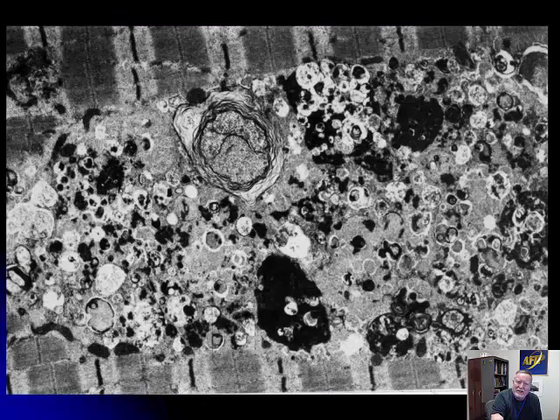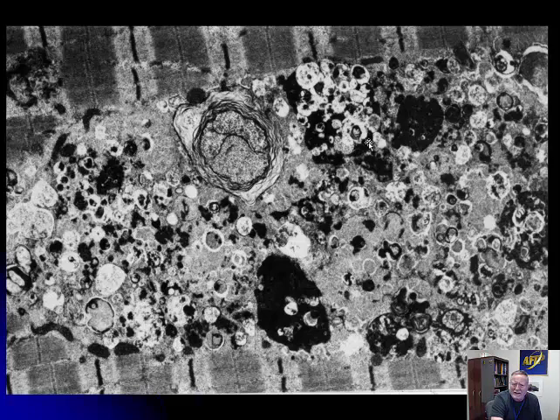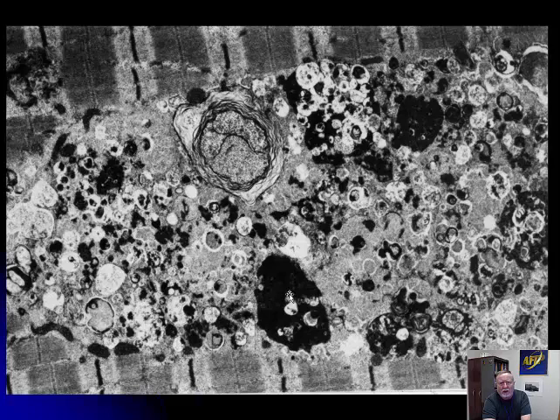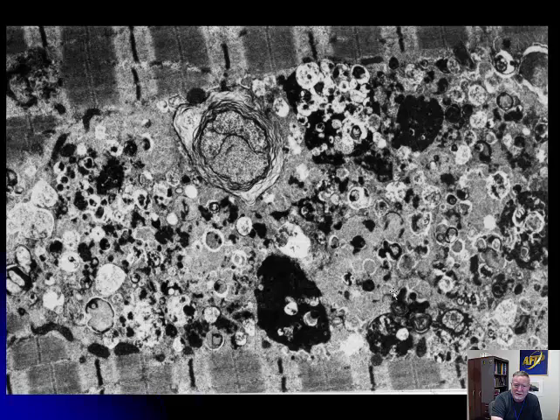Damaged skeletal muscle — here's an odd case of acid maltase deficiency, which is type 2 glycogenosis, also known as Pompe's disease. You can certainly say this cell is irreversibly damaged, with damage to both extra- and intracellular membranes. Look at the formation of these lamellar or zebra bodies, the large numbers of autophagosomes, and the really black staining, which is probably a lot of free lipid. I'm always amazed when the adjacent cells look actually pretty good.